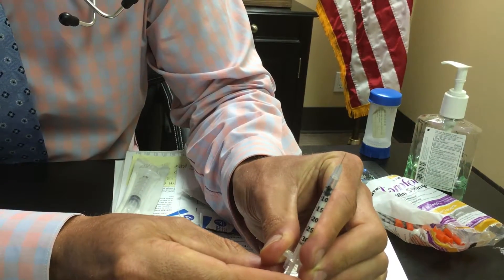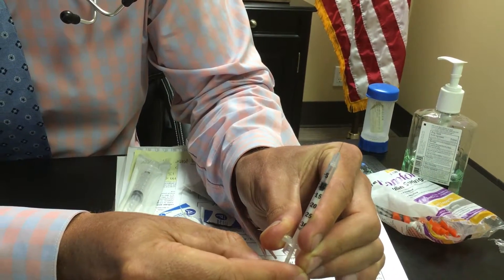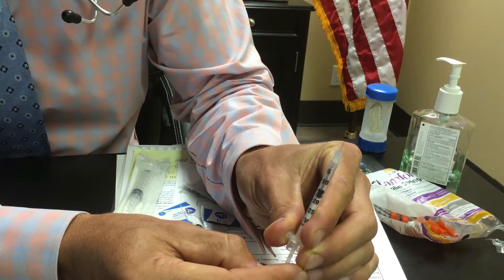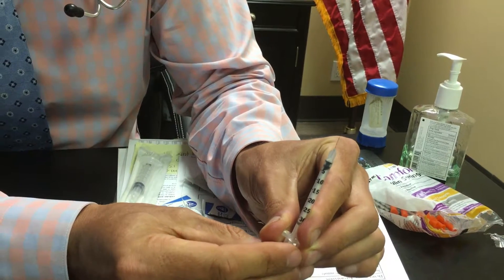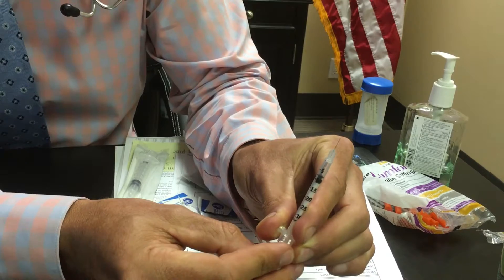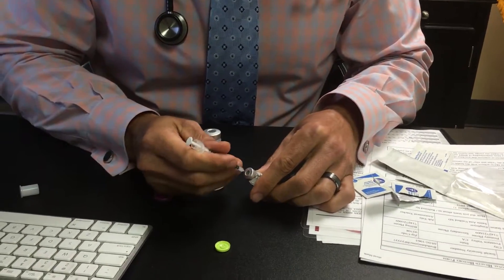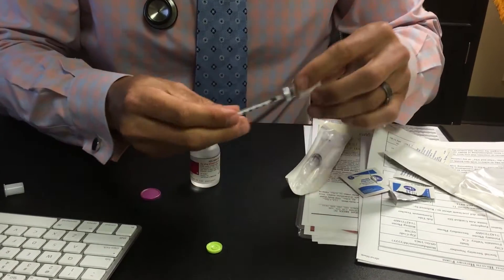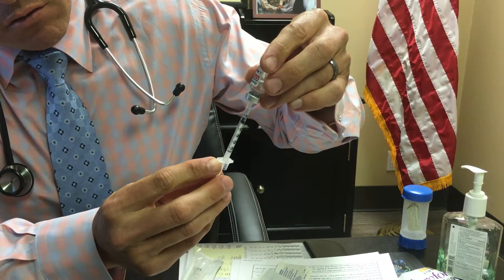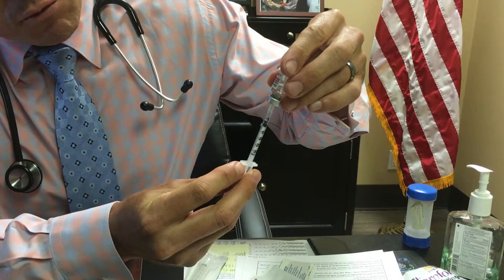If you pull to the 5 line that's 0.2 milligrams; the 7.5 line is 0.3 milligrams; the 10 line is 0.4 milligrams; and the 15 line is 0.6 milligrams. I'm going to have you pull to the 7.5 line to start — that's 0.3 milligrams a night. Stick the needle in the center of the Omnitrope vial, turn it upside down, and pull out enough fluid to reach the 7.5 line.